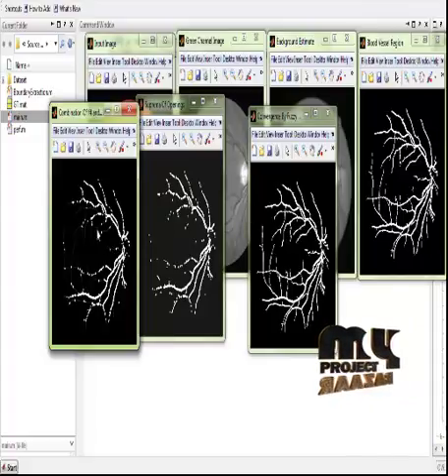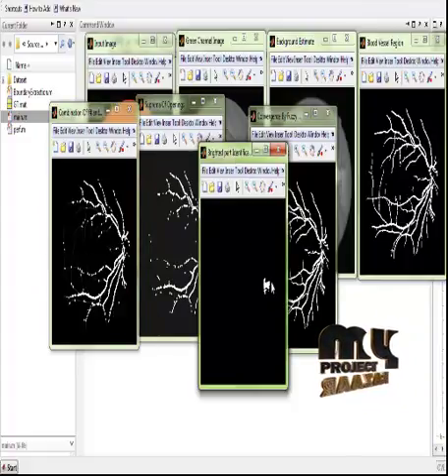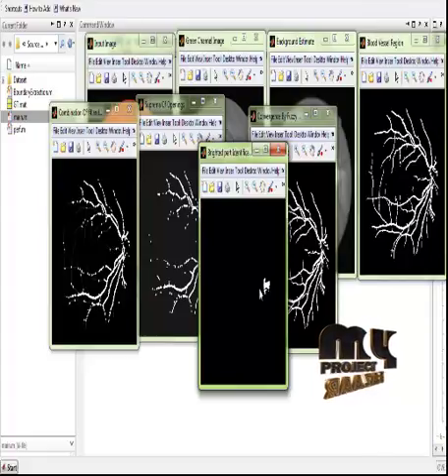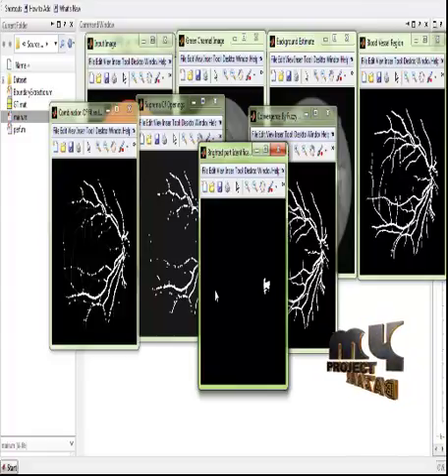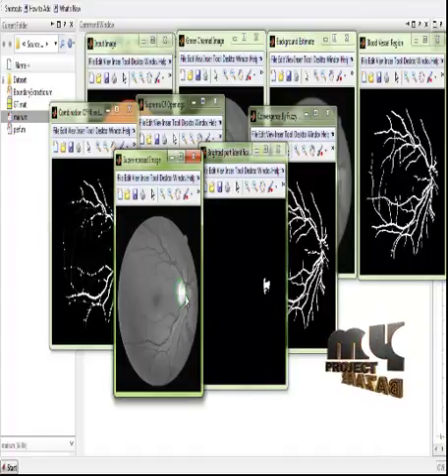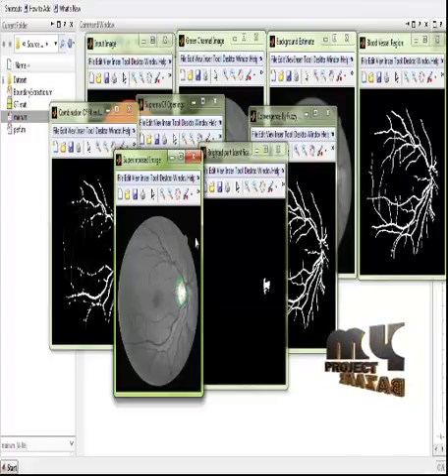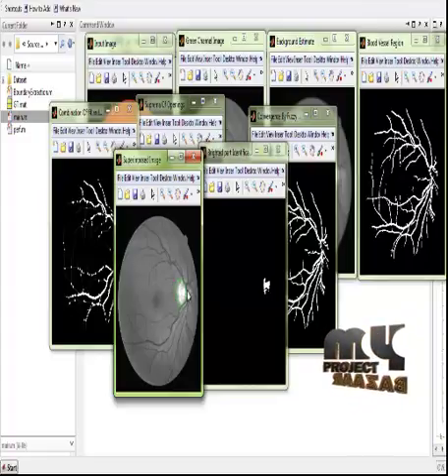This identifies the blood vessel regions in the input images. The brighter regions are then identified based on the identification of the maximum pixel in the input green channel. The maximum pixel is subtracted by 10 or 20, so that we obtain the brighter regions in the input images more exactly. These brighter parts are identified in the input images, and this brighter region is superimposed onto the original image. An outer contour is then drawn in the input images.